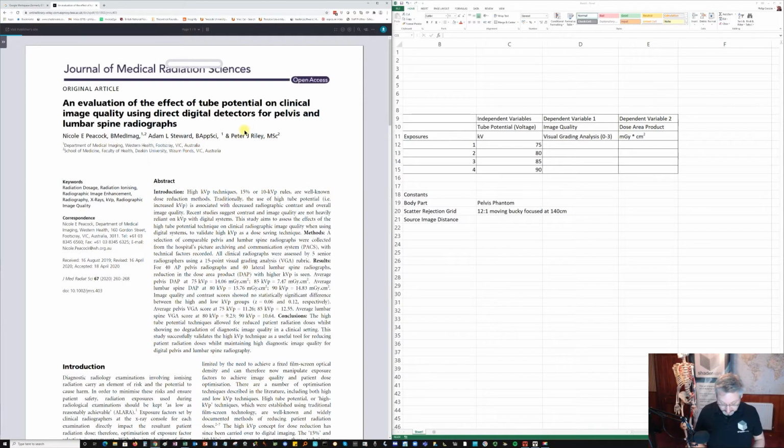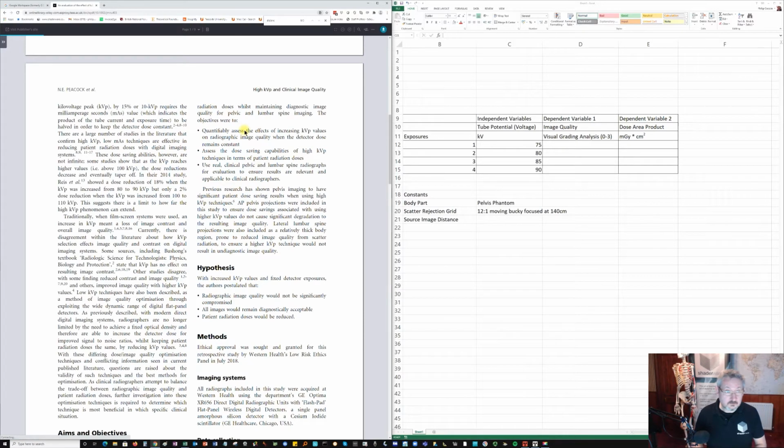So I'm going to Control F and search SID. They don't use that terminology. What about FFD? Do they? Distance. What about distance? Okay.